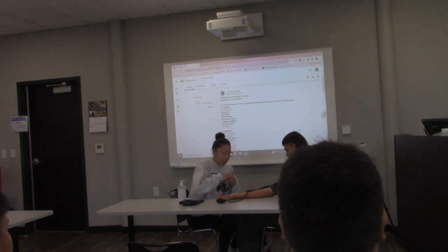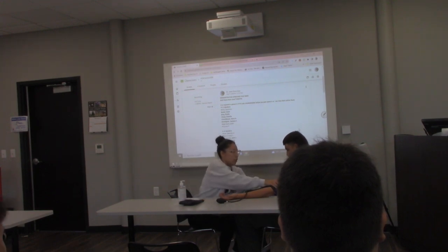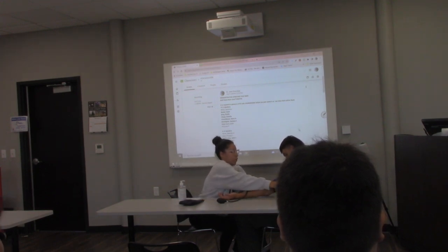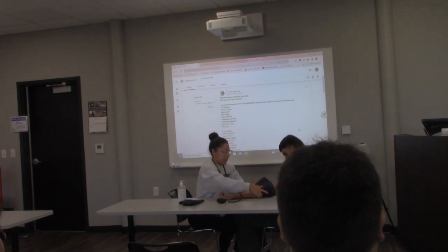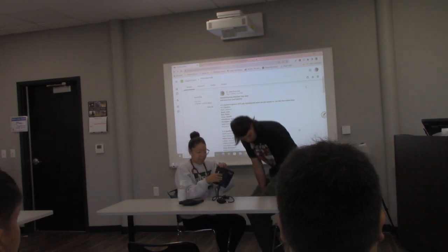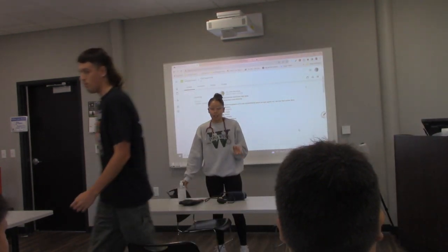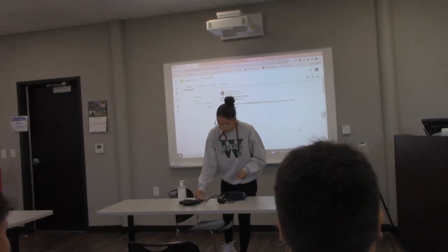I got about 110 over 70. I'm going to release the cuff off of the patient. Since it was 110 over 70, that is a normal blood pressure.